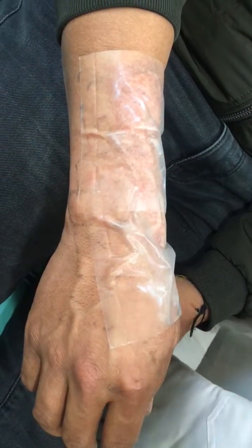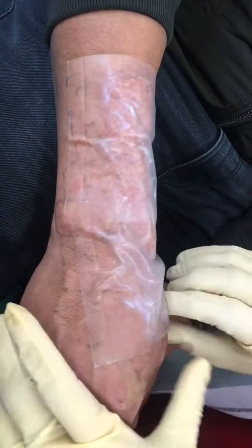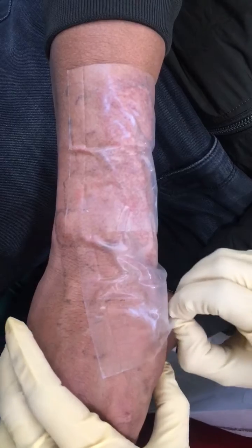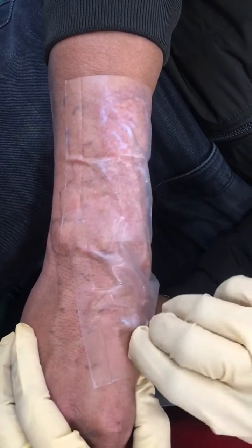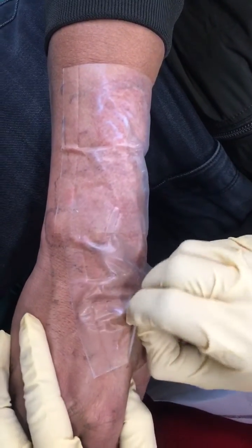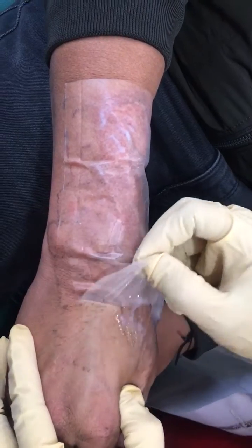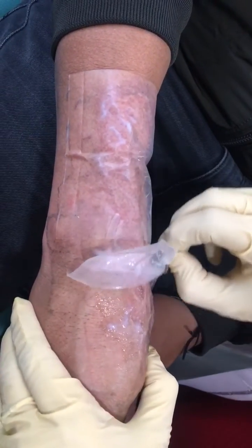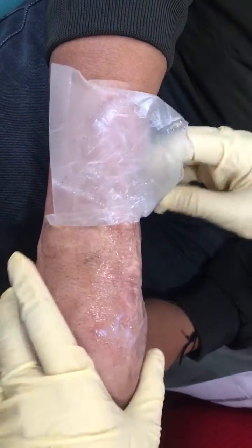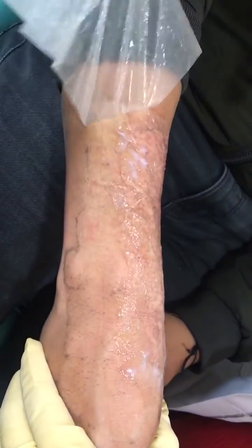He's a patient with an accident scar on his hand. We have anesthetized the area for one hour after applying the EMLA cream. Now we are removing the occlusive dressing and exposing the scars.